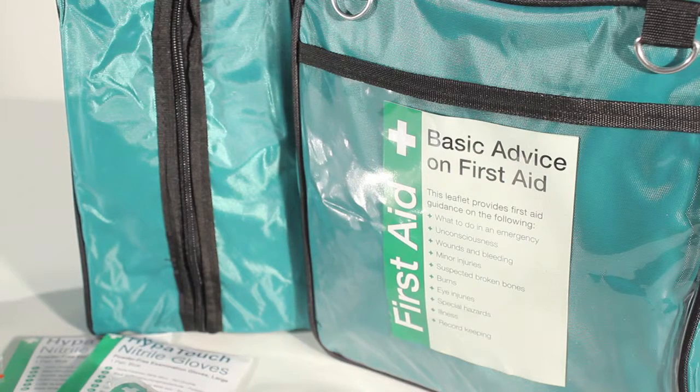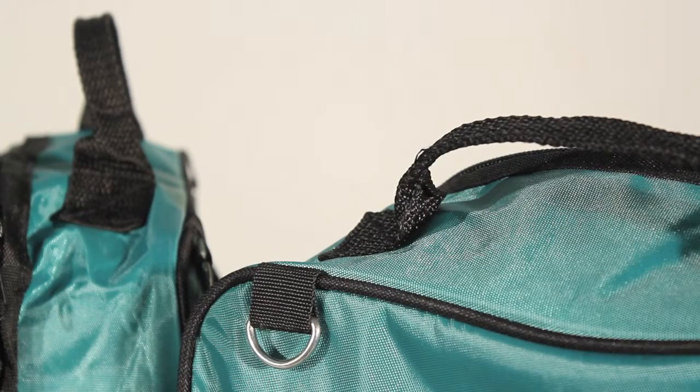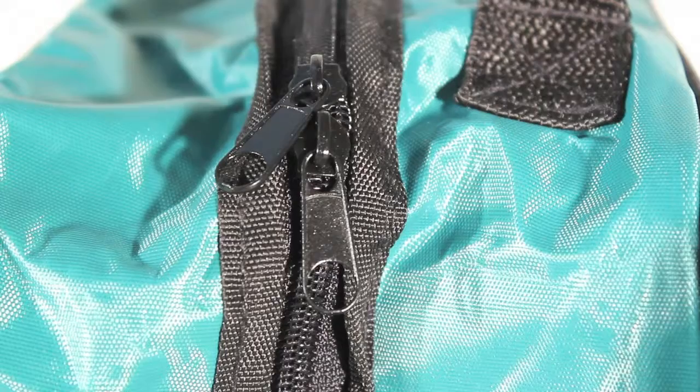The compact design allows easy storage even in tight locations like desk drawers, but also makes the first aid kit easy to be transported to where the treatment is needed. The Grab Bag has a double zip closure system and a reflective strip making the kit easier to find in dark conditions.